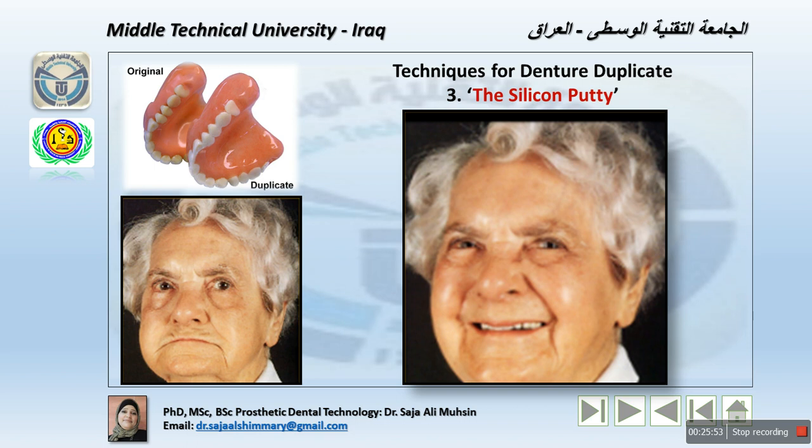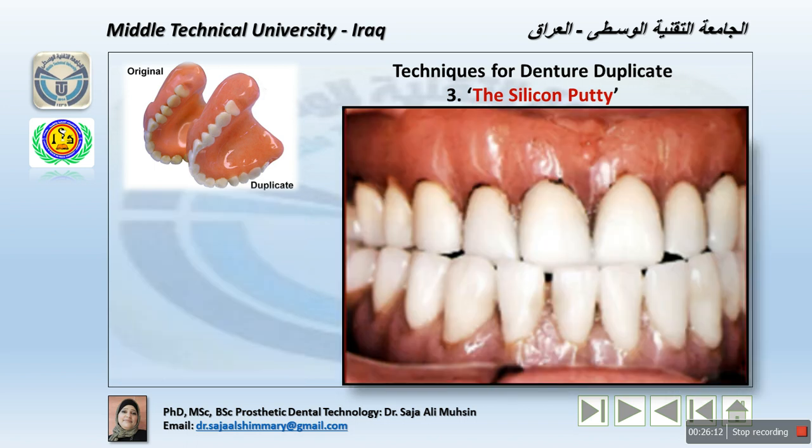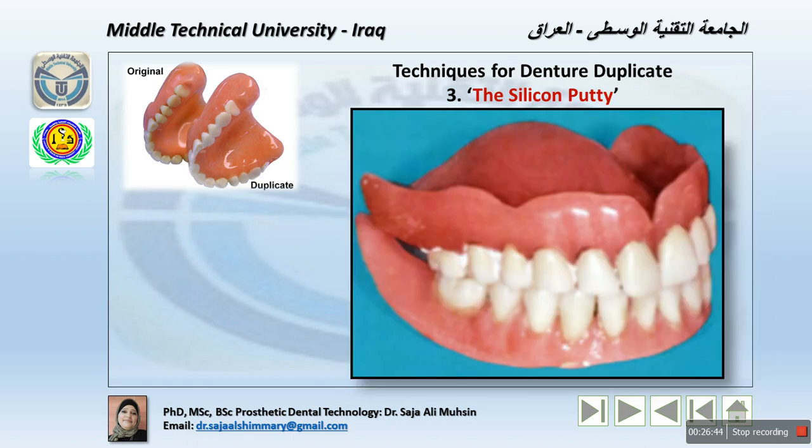She is happy with her old denture, but we need to modify many things to have a fully satisfied patient with a functional denture. The intraoral occlusion of her old denture suggests anterior crossbite, indicative of alveolar ridge resorption. And this is one of the indicative factors regarding the resorption of the bone. The patient is happy with the denture itself, but we have a problem of malocclusion related to the resorption of the bone. However, extraorally, the dentures can be occluded in normal centric occlusal contacts. So the problem is we have to fix the relationship inside her mouth to make the denture functional.